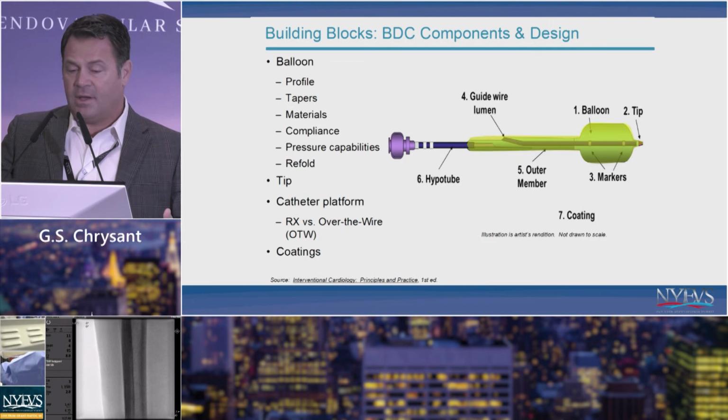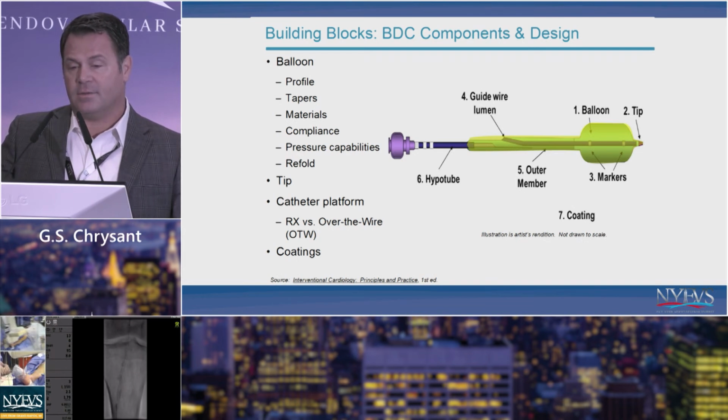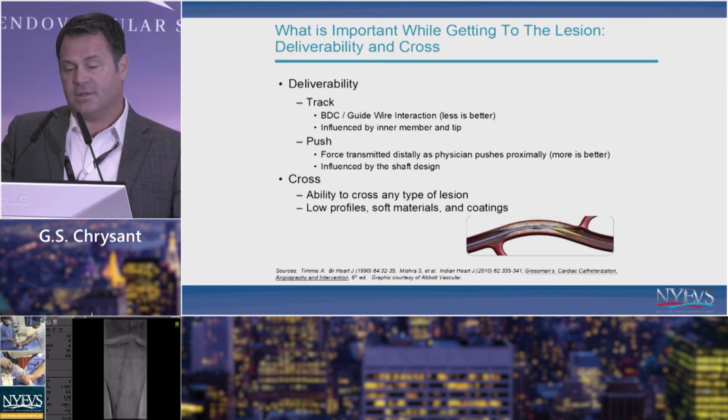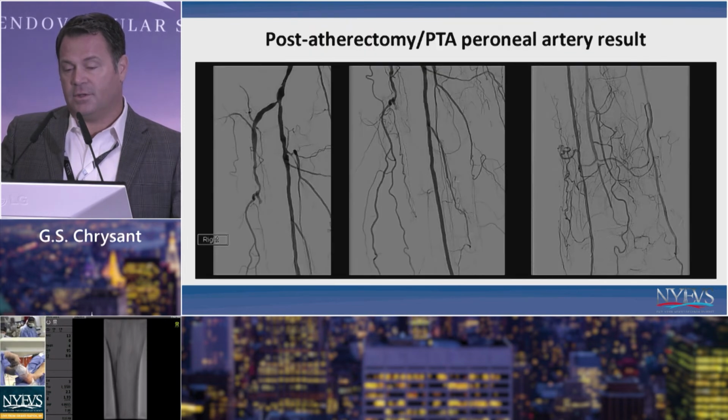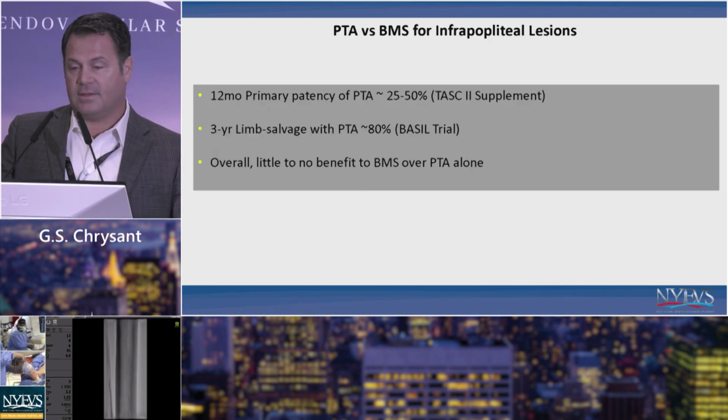And then a lot of times, again, when you're using coronary equipment, you find sometimes that RX balloon gives you a little bit better push. Sometimes over the wire is better. And this is just another concept. So balloon, you just want to be able to track it and make sure it gets to where it needs to be. And then this is the final result of that case.